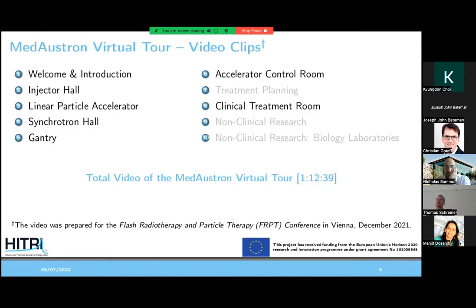This made it quite difficult for the helium ions, because for the helium ions we have a different charge to mass ratio of 1/2, and therefore we have different settings for the injector chain, mainly for the linear accelerators. But as I have said, we have finally succeeded there, and we have quite good transmission. We are already at the end of the second linear accelerator, and we are already commissioning the medium energy beam transport line. But this was just a side remark on the current activities here at MedAustron.